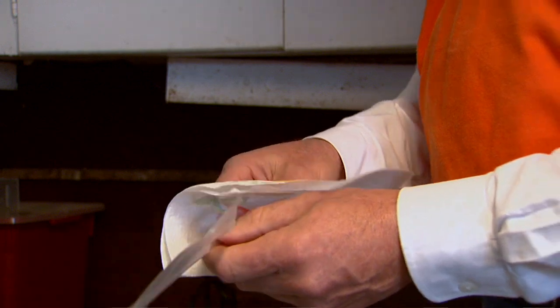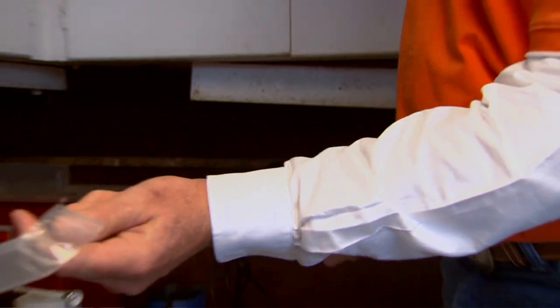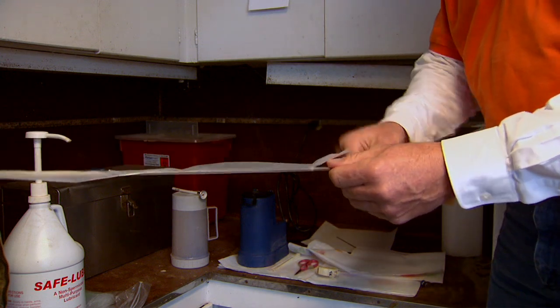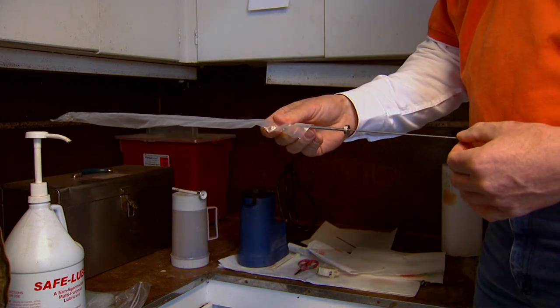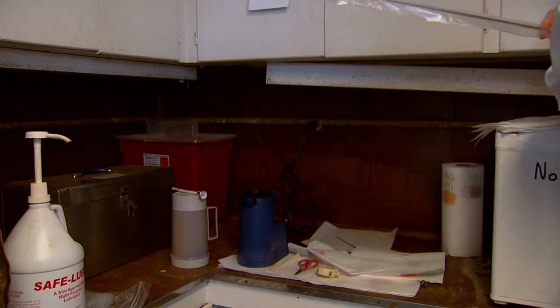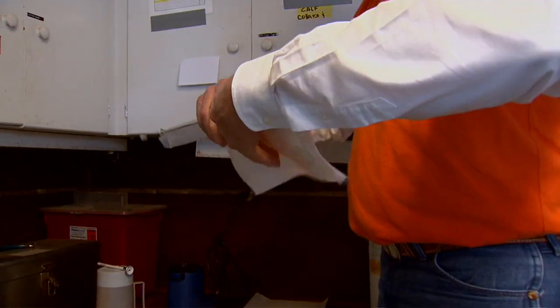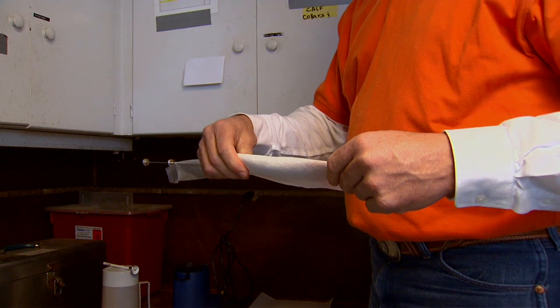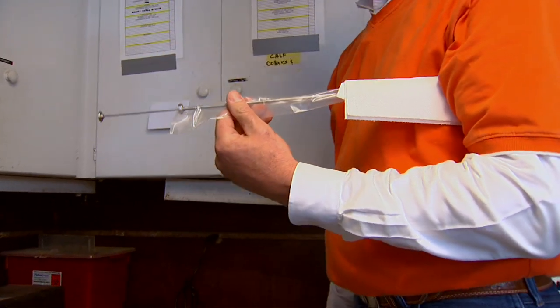We're going to place this into the gun, snap that in, and draw our plunger back. We place this in and twist that on, making sure we bump up to that cotton plug that's in there. We're going to wrap the gun with a paper towel, and as we go to the chute to breed the cow, temperature is a concern — so I'm going to place that straw under my arm and try to keep it warm as we go to the cow.